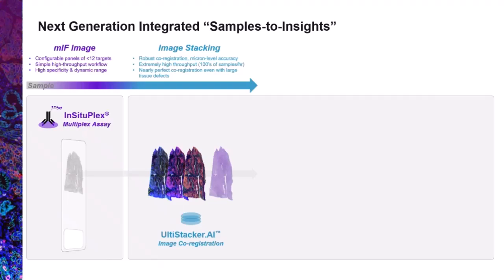And this can also be computationally quite challenging. Our technology is always applied on the whole slide, so big resections can have millions of cells, and therefore we invested a lot in having highly scalable solutions.